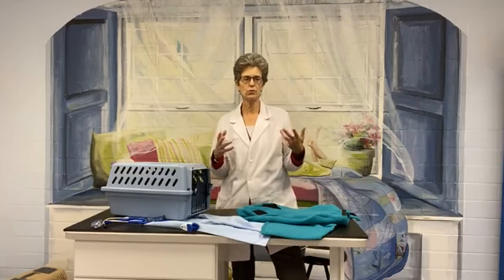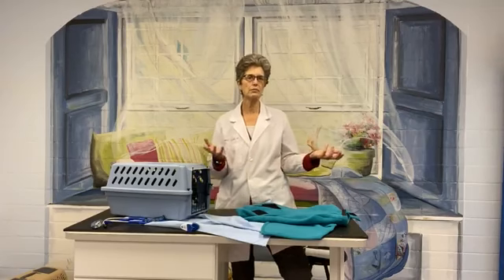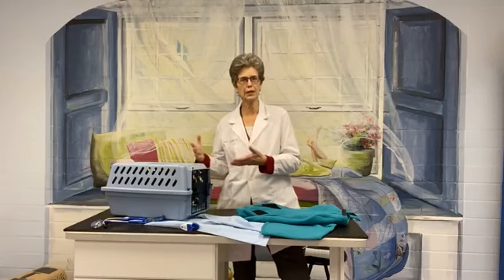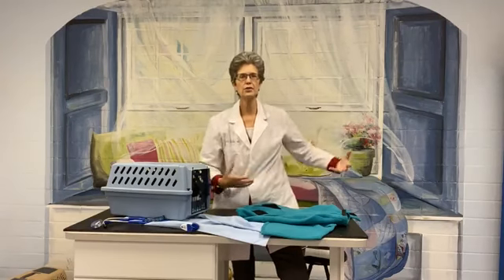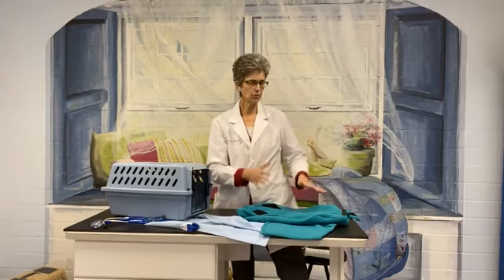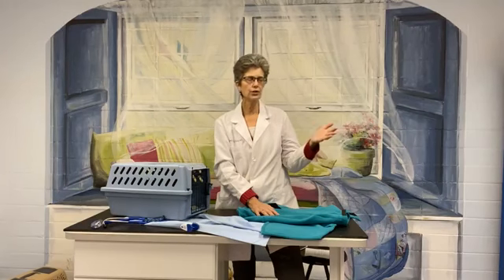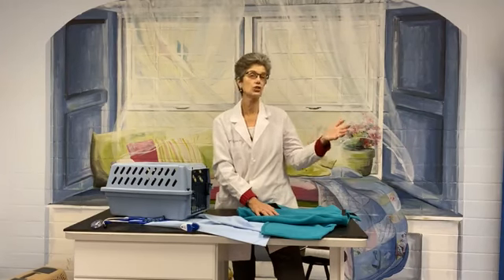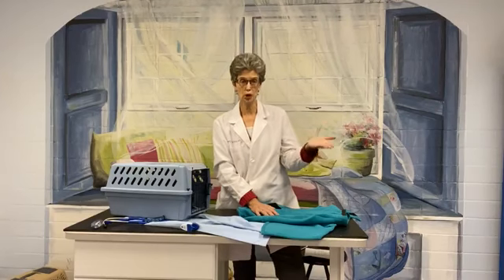For veterinarians or technicians who may have to work alone, a lot of our practices now have had to go to more limited staffing and team staffing during the curbside care, which is still present in most of our practices. So we have fewer people to help each other, and we don't want 3 people all together around a treatment table. So having the cat in the wrap like this can help a veterinarian or veterinary technician, assistant, or shelter care worker, or even a cat owner, work alone.